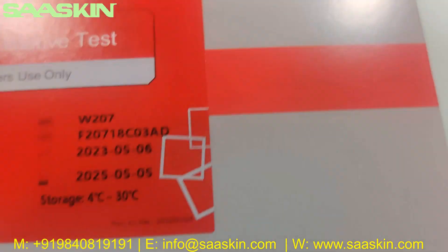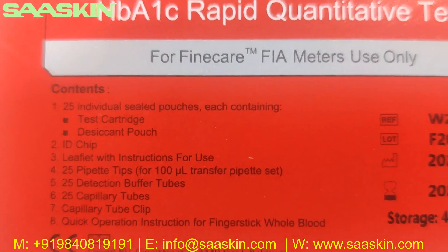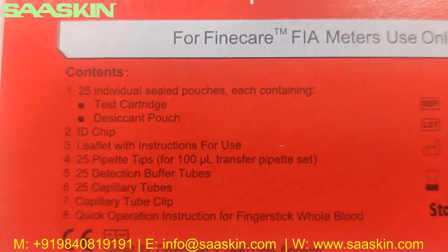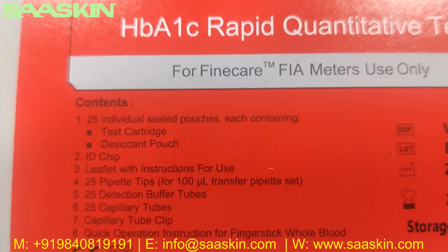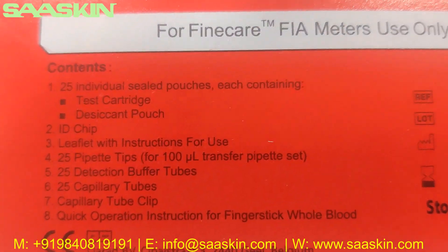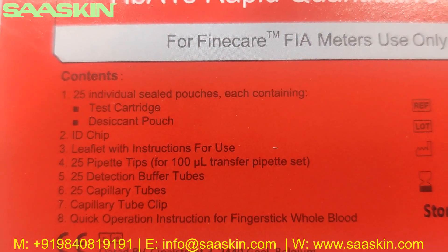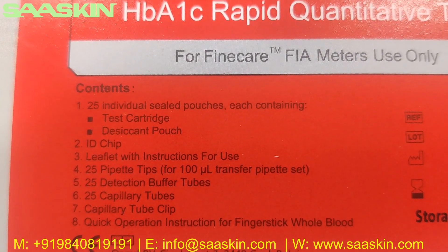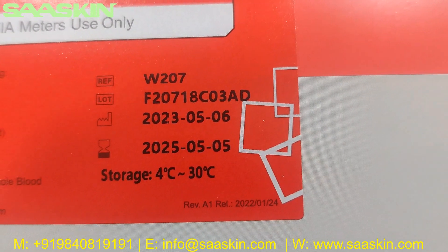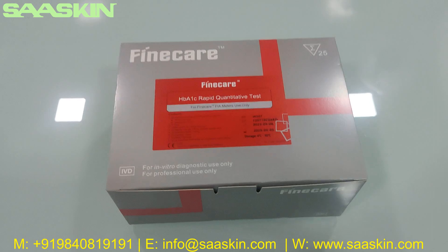This is a 25 test kit pack. You can see the key contents listed here: 25 individual test pouches, an ID chip, a leaflet, 25 pipette tips, 25 detection buffer tubes, 25 capillary tubes, and quick operation instructions. You can also see the storage conditions and the standard expiry period of 2 years. This is how the box looks like.